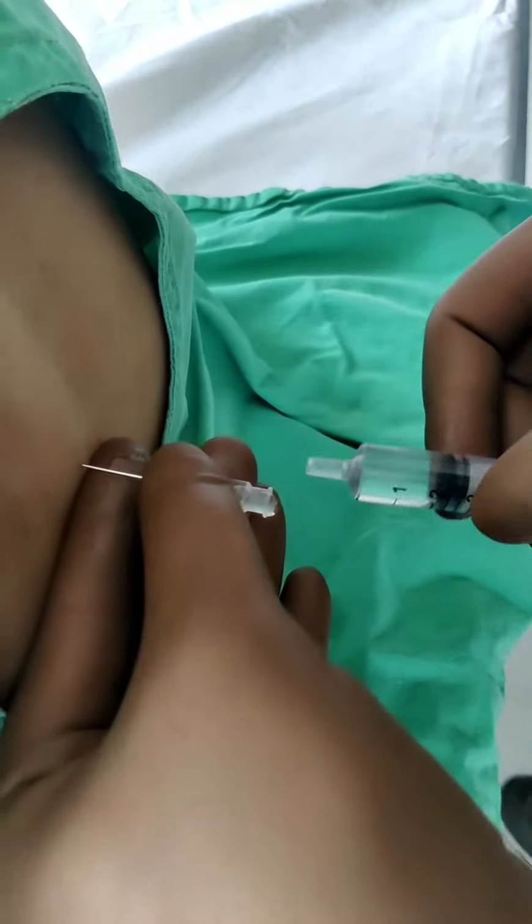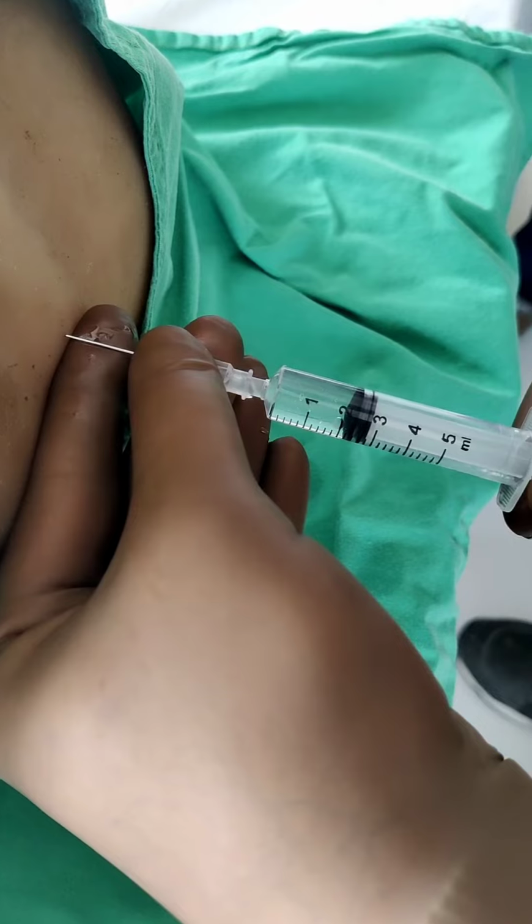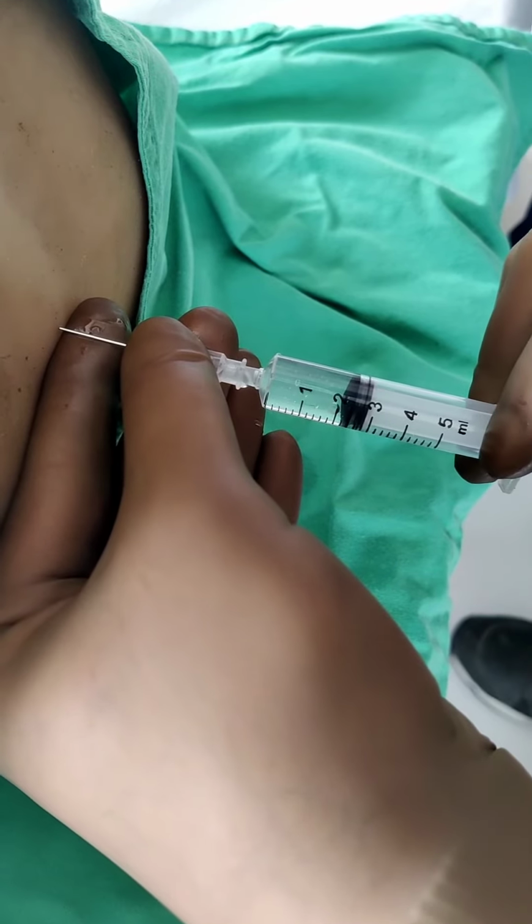After free flow of CSF has been confirmed, we'll attach the syringe containing the spinal drug, aspirate for blood and free flow of CSF, and inject the drug.